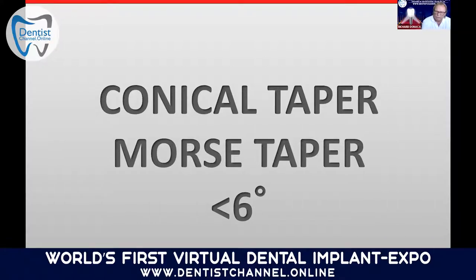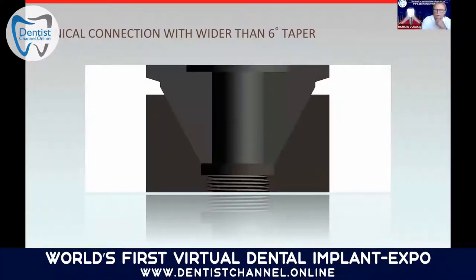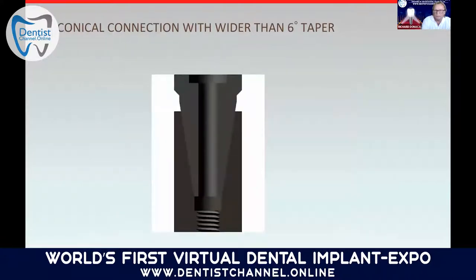So you have a very tight seal of the connection, whereas wider taper conical connections say it's conical, but still have the problem that they also have tolerances and not quite the bacterial seal. Once you release the screw on a wider connection, then you can remove the abutment without any problems. The 6 degree taper, or less than 6 degree taper, causes a tight connection of the implant and the abutment, and you really have after that a one-piece implant.